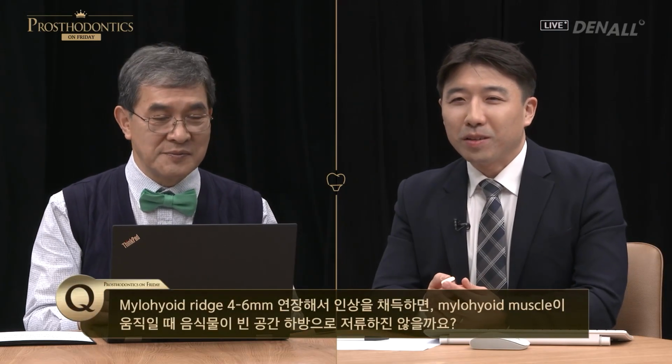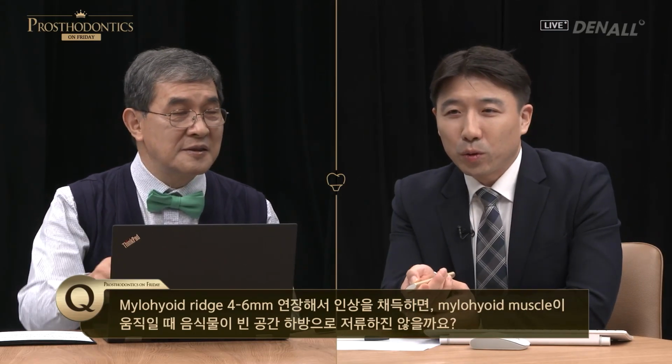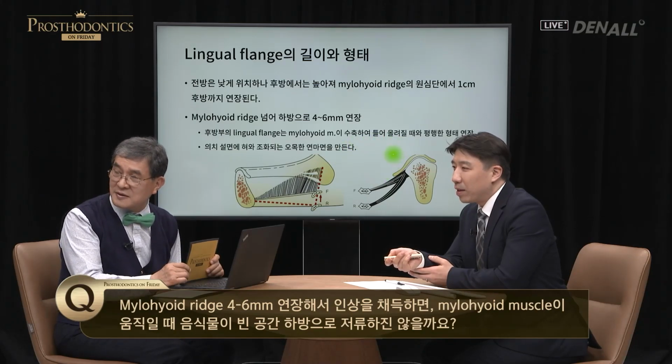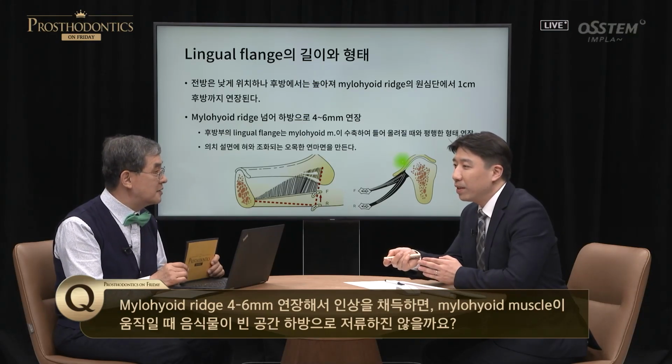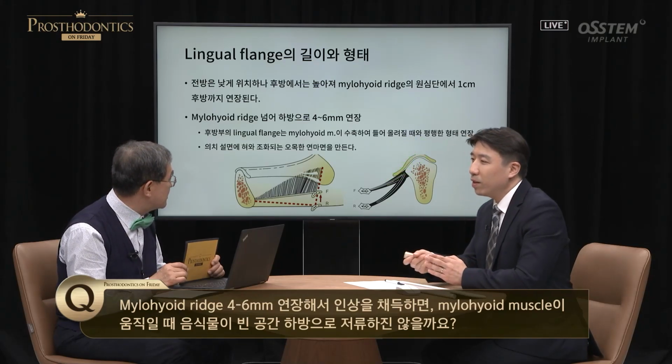Thank you for the question. It's not reflected here, but in the middle there's the tongue, as mentioned. The tongue contributes in stabilizing the denture. The structure is shown here on the lingual side, concave.